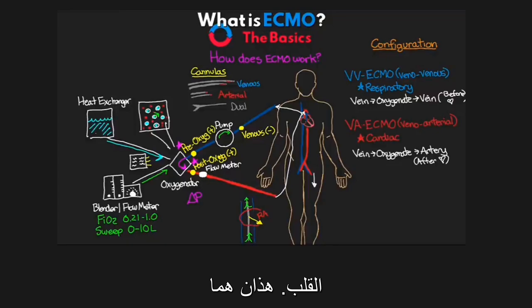Now, these are our two basic ECMO configurations that we're going to see. There are other configurations, but really for this lesson, that's going to be the scope of what I'm going to talk about here. All right, so now let's talk about why it is that we would use ECMO for our patient.